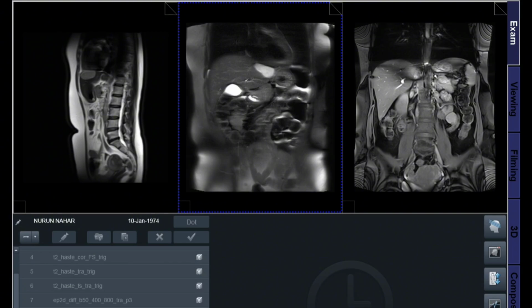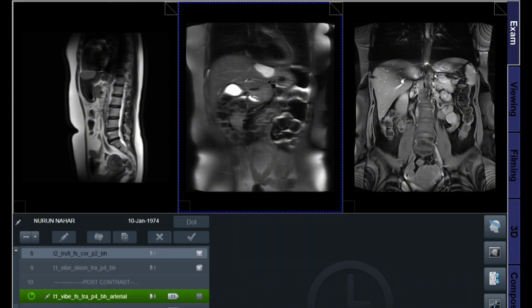Clinical importance. MRI HBS plays a vital role in early detection of liver tumors, accurate staging of malignancy, surgical planning, treatment monitoring, non-invasive biliary evaluation. Conclusion. In conclusion, MRI HBS is a powerful diagnostic tool for evaluating hepatobiliary disorders.